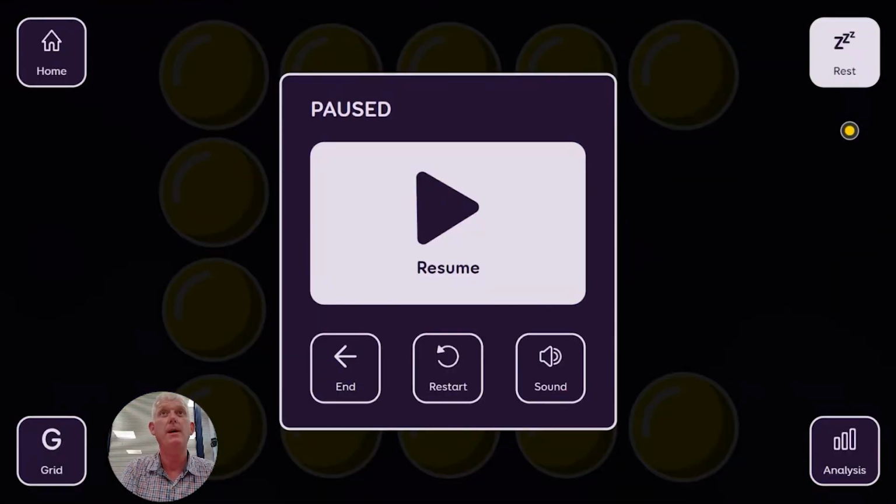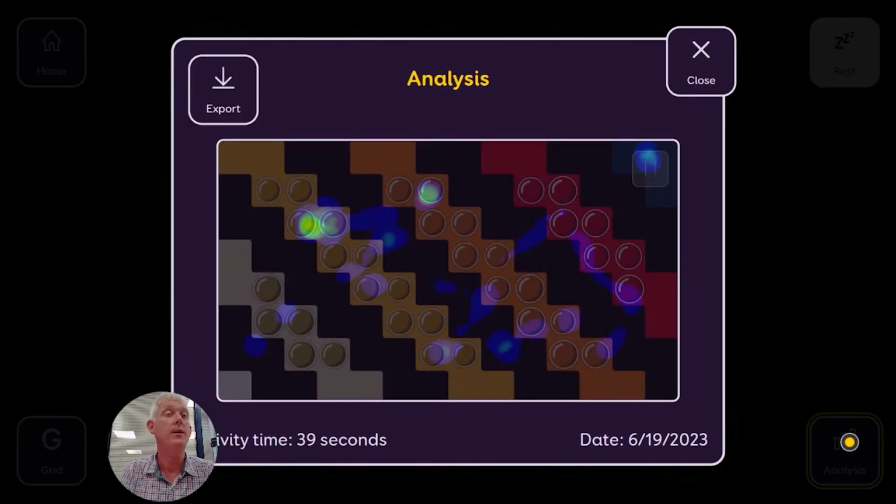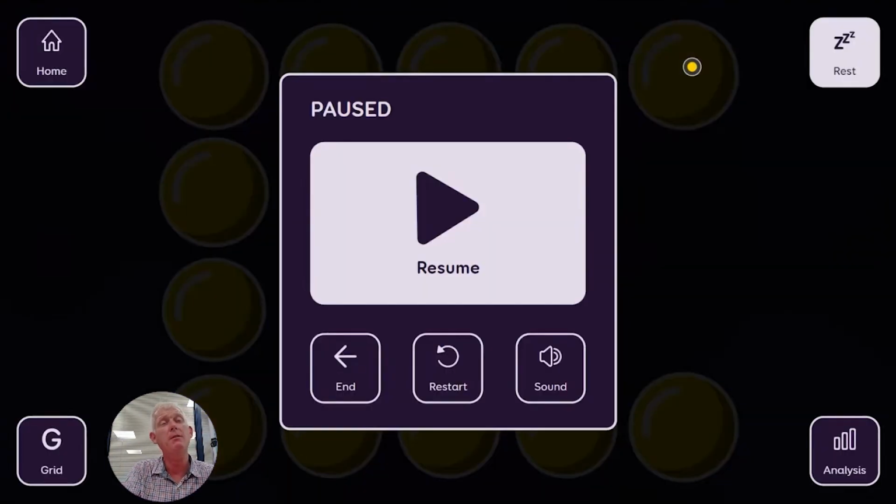We can also think about recording where it was that he looked. How long did we take? Where was he able to see on the screen? And the hotter the colour, the longer he was looking at the screen. So we can begin to see whether there are any gaps there, and then anything that we might need to work on, and look for activities where we have got stimuli in certain areas and not in others, and so on.